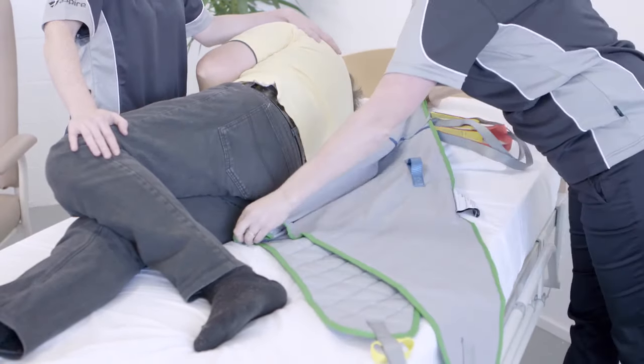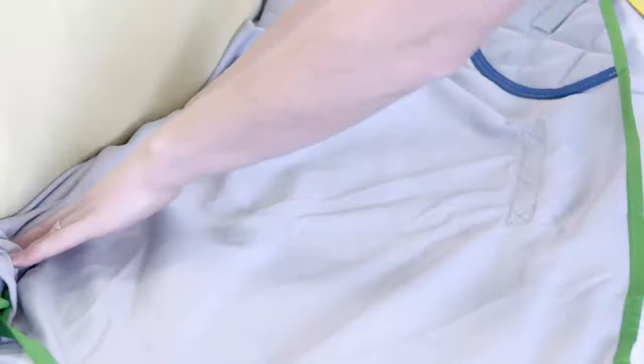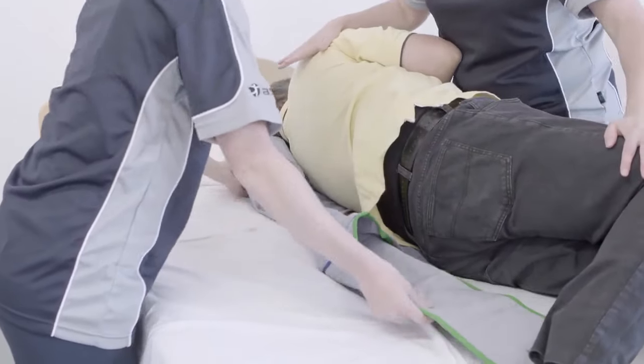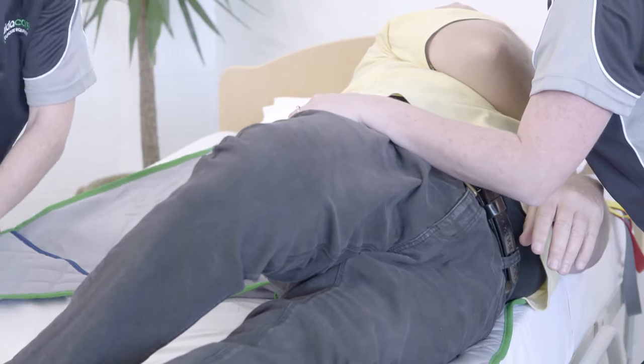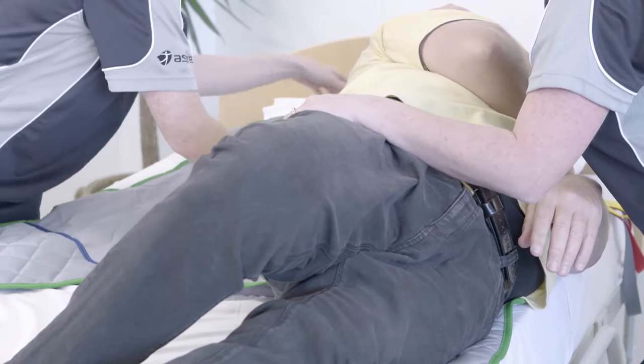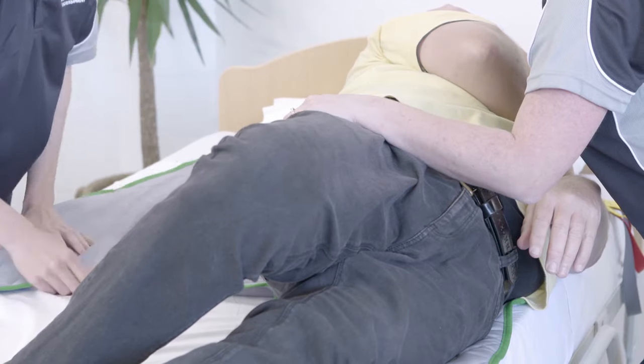Then feed the sling under them. Help the resident to roll to the opposite side and unfold the sling so that it is central and in place. Ensure that the sling's material is not bunched up to avoid skin tears. The resident can then be assisted to roll onto their back.